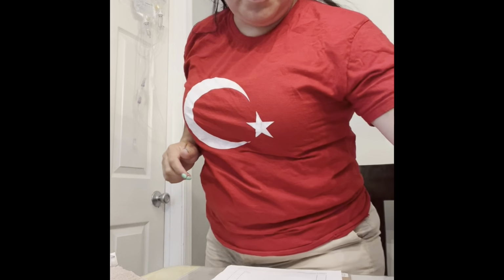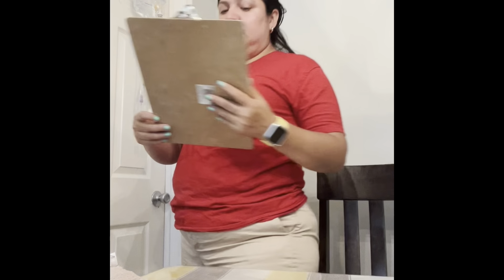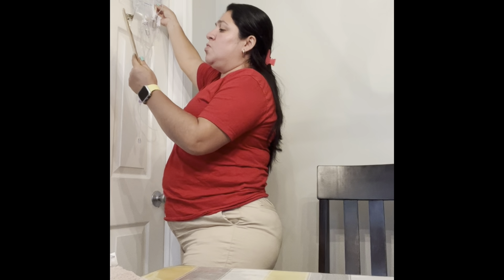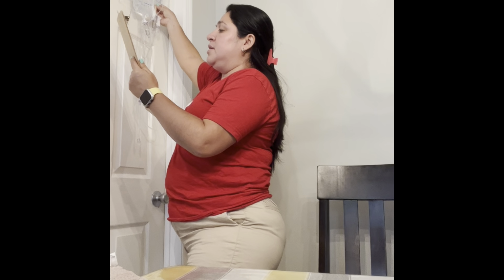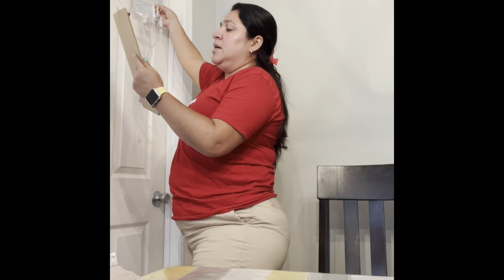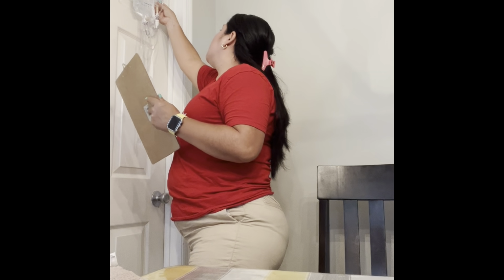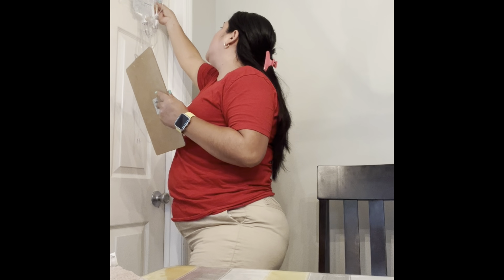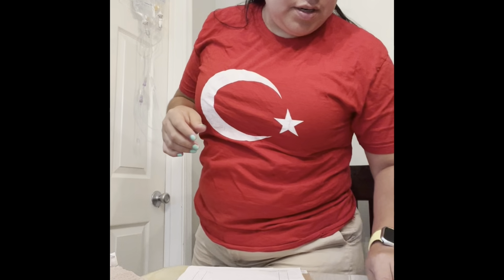I'm going to wash my hands, put on gloves, and I am going to double check. I have cefazolin sodium 1 gram intravenous piggyback to be given in 50 ml of normal saline over 30 minutes via gravity, 15 drops per ml tubing. The time is now, and it's going to be 25 drops per minute. 1 gram cefazolin sodium and 50 ml sodium chloride bag. It's correct. Medication is not expired.